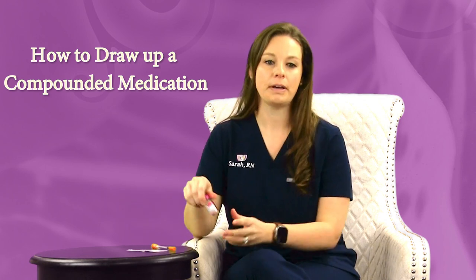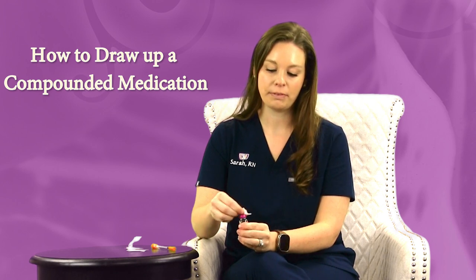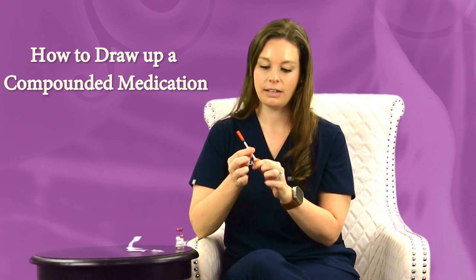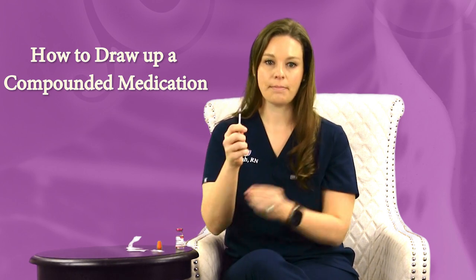How you draw up a compounded medication is first you're going to open your alcohol swab and wipe off the top of your vial to make it sterile. Your insulin syringes are going to come like this — you're going to take the bottom off, it's just a safety cap, and then the top is your needle.